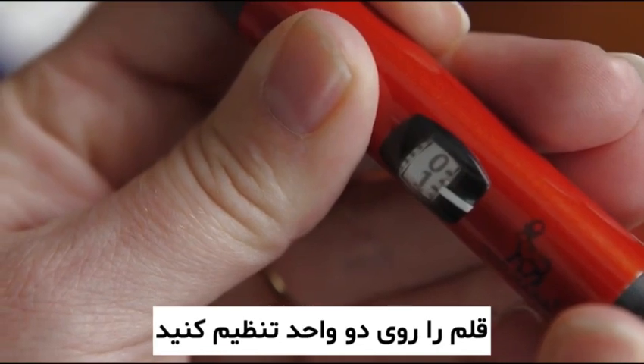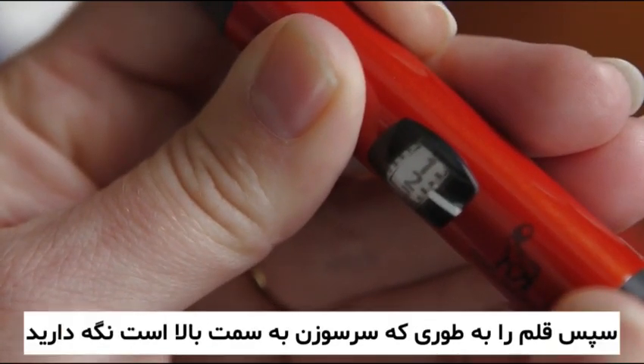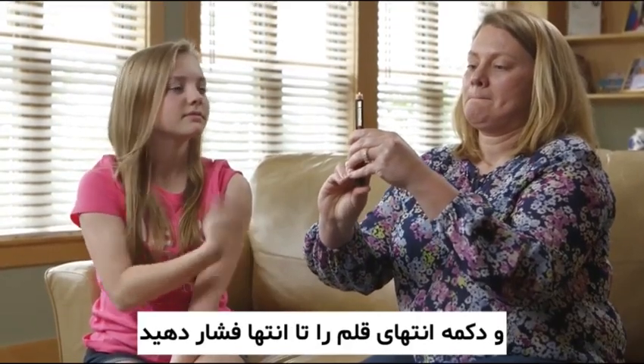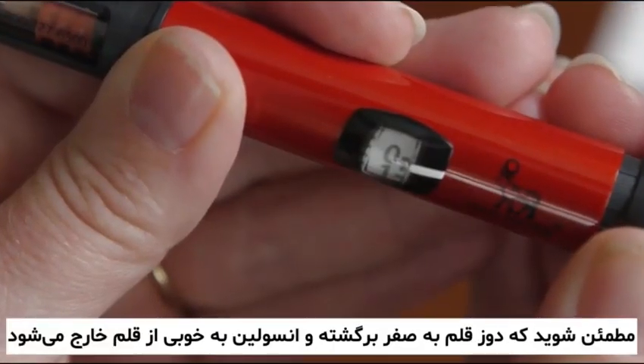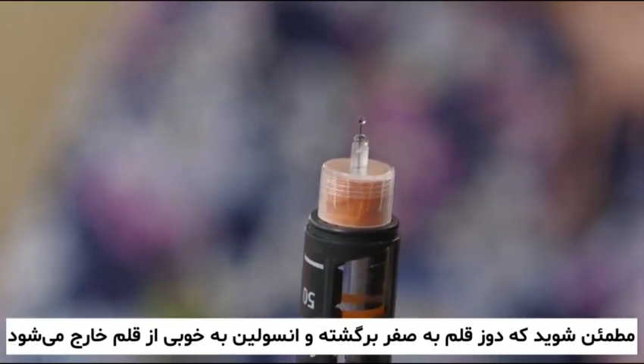Prime the pen needle by dialing the pen to two units. Holding the pen with the needle upright, push the button all the way down, making certain that the dose dial returns to zero. You should see a stream or squirt of insulin from the needle tip.